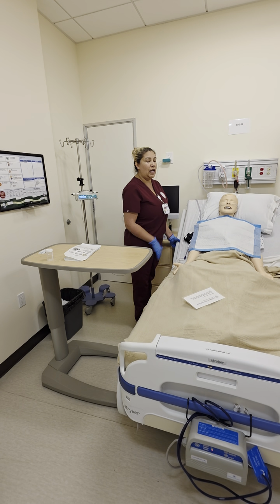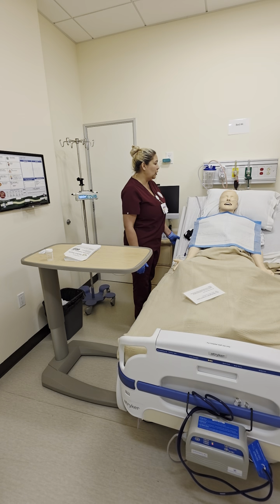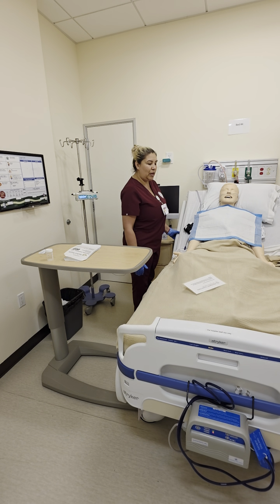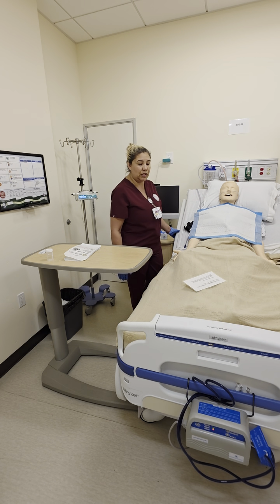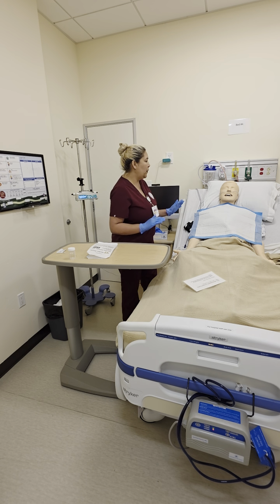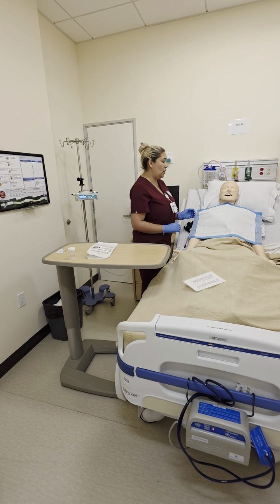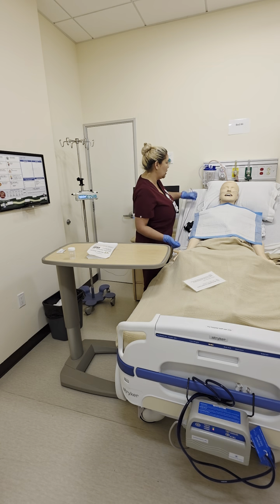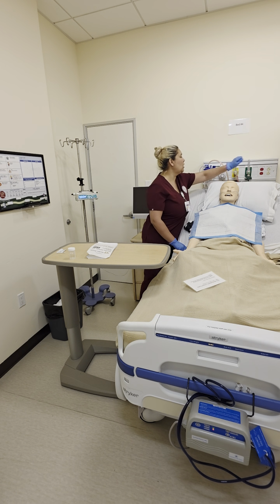My patient was already in a semi-high Fowler's position, but if he wasn't, I would make sure that he was in a high Fowler's or semi-high Fowler's position, so it's a good working condition for the suctioning, and also making sure that he's upright. Okay, everything is good. I tested my canister. I'm going to turn it on between 80 and 150, 80 for pediatrics, 150 for adults. I'm going to turn up the oxygen on my patient.